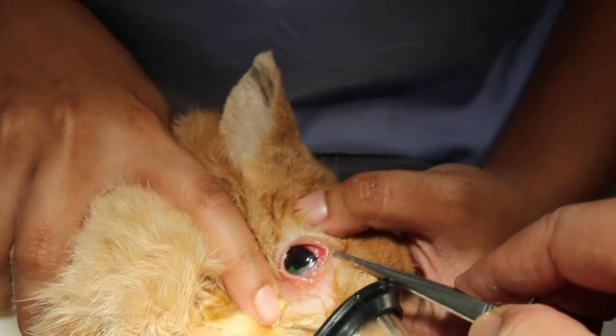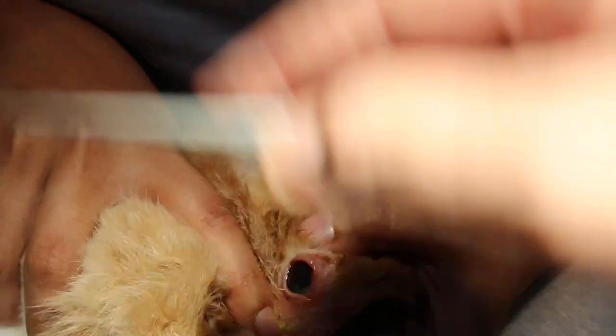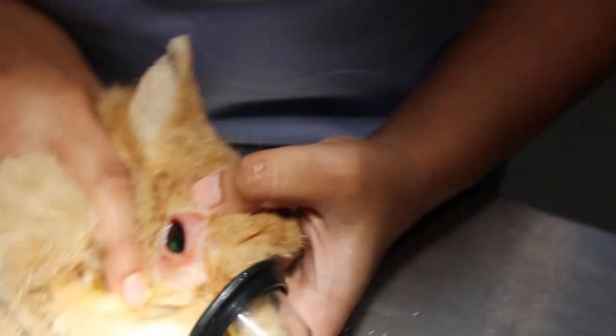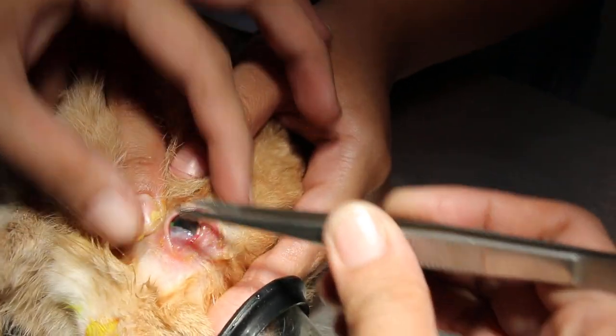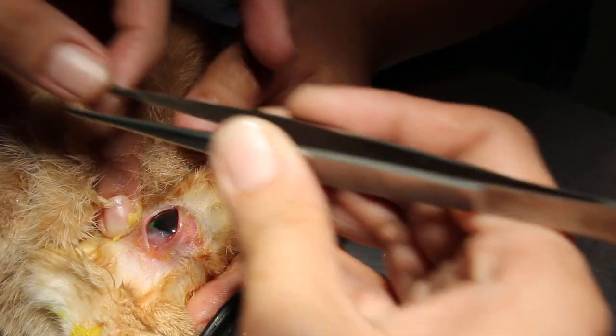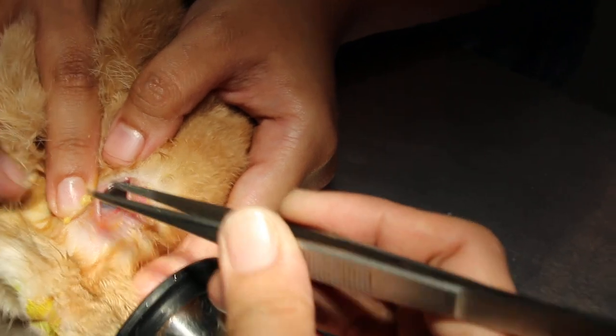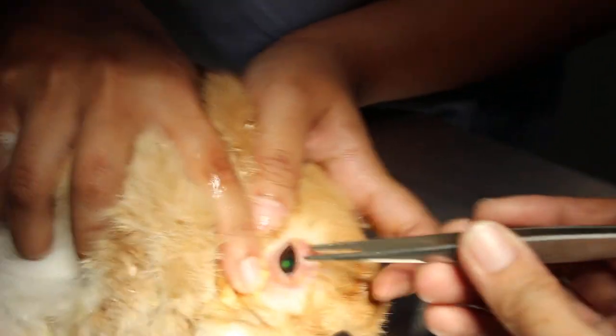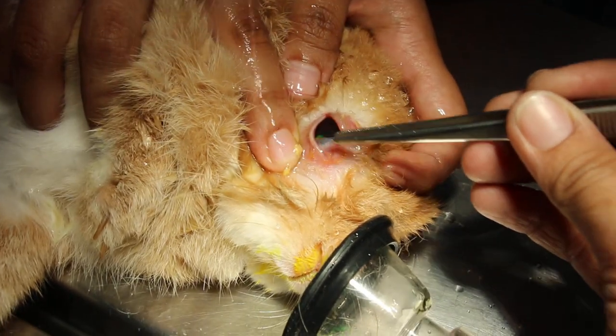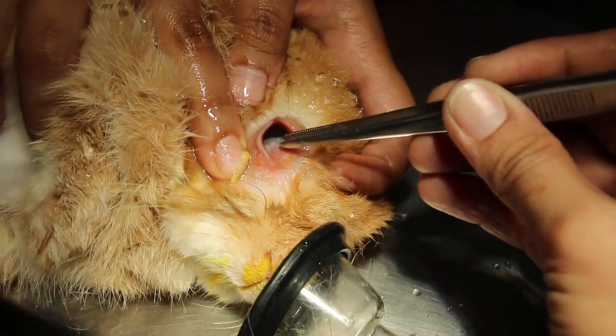Now we open. You can see the fluorescein stain. My assistant will pull up and flush — get ready to flush with saline. There may be some hair trapped inside.